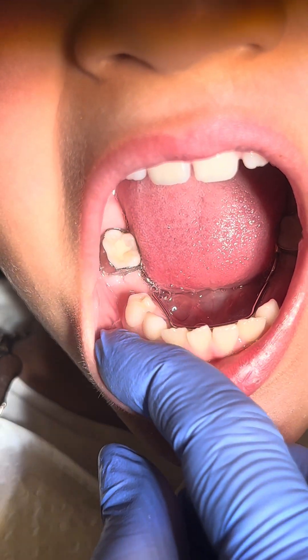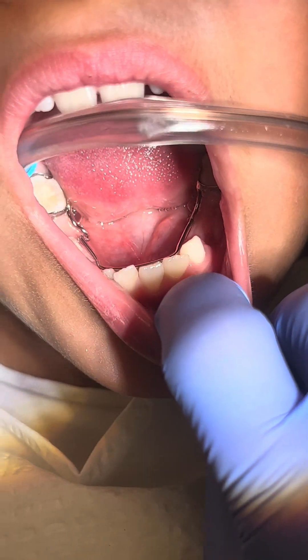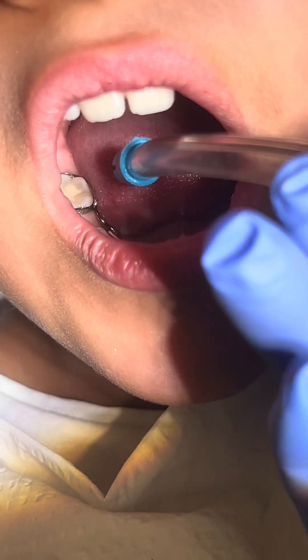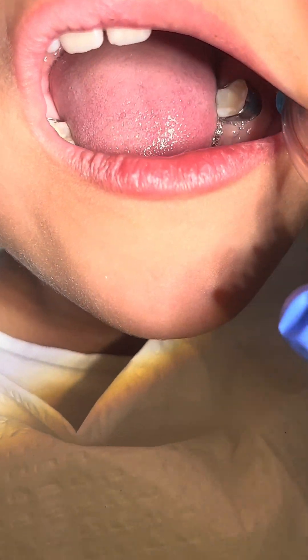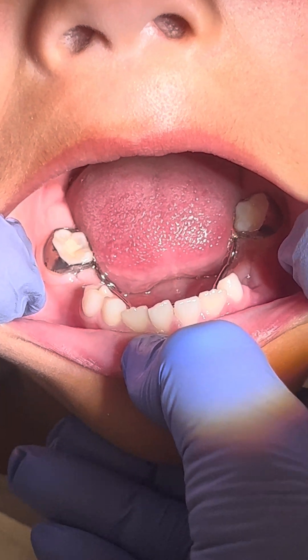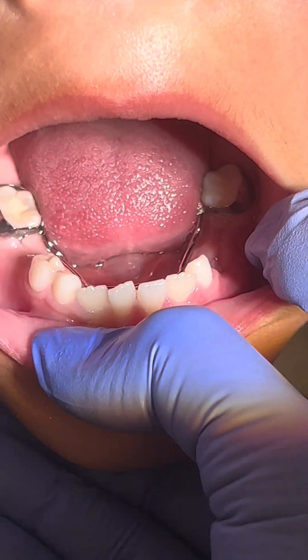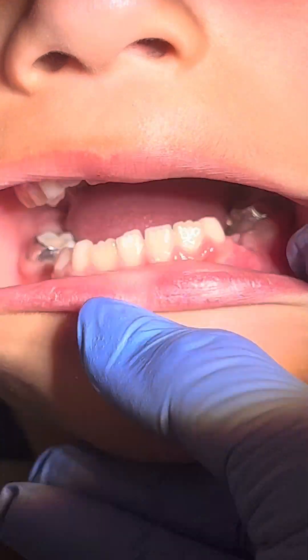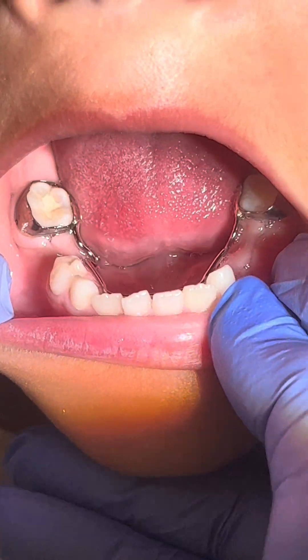How long does a space maintainer stay in? Space maintainers can remain in the mouth until the adult teeth push the spacer out. Spacers can also be removed before an adult tooth pushes it out. Metal spring-type spacers need to be removed when the adult tooth starts growing in.